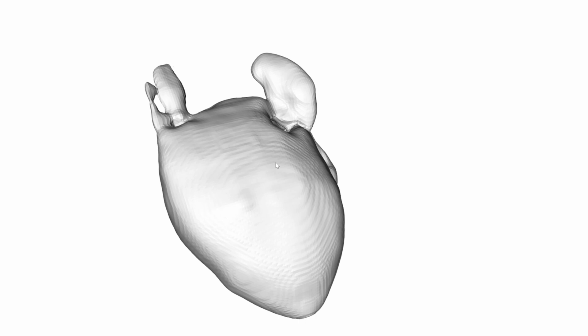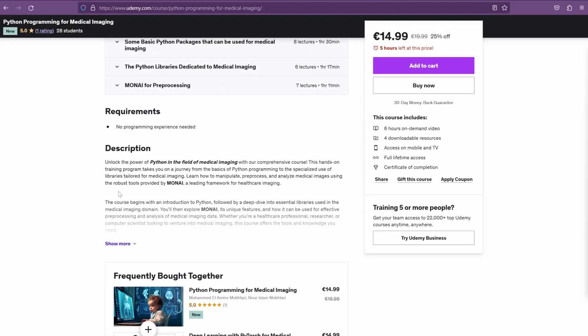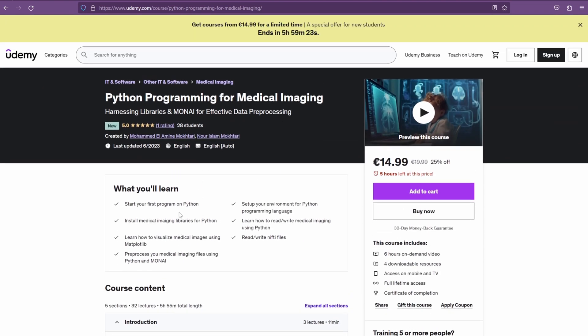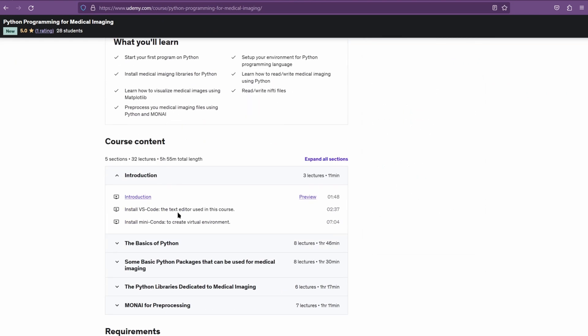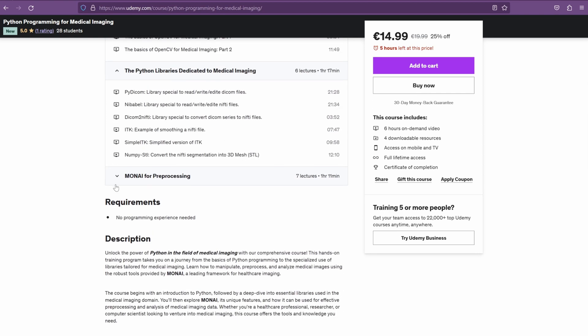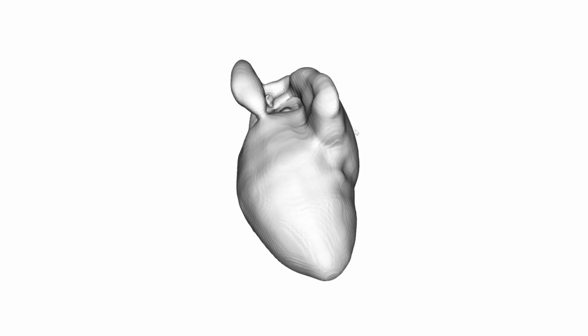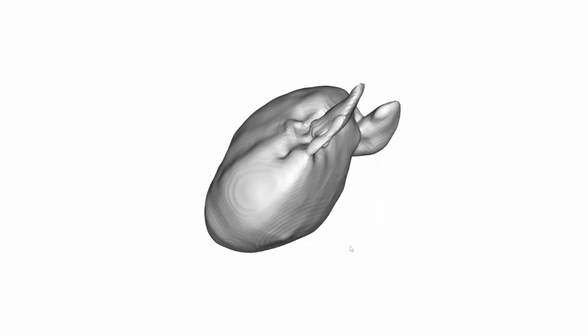So if you want to do 3D visualization for STL mesh files using Python, VTK makes it straightforward — it works for any type of STL file. By the way, if you're interested in diving deeper into medical imaging, I have a comprehensive Udemy course designed for all levels. Also, the same concept can be applied to visualize NIfTI files for volumes and segmentations, though the code would need to be slightly adapted.